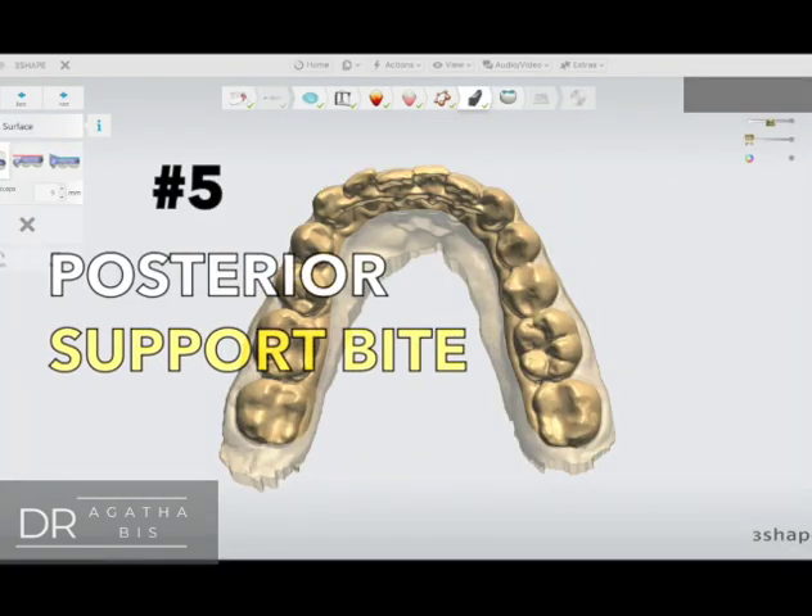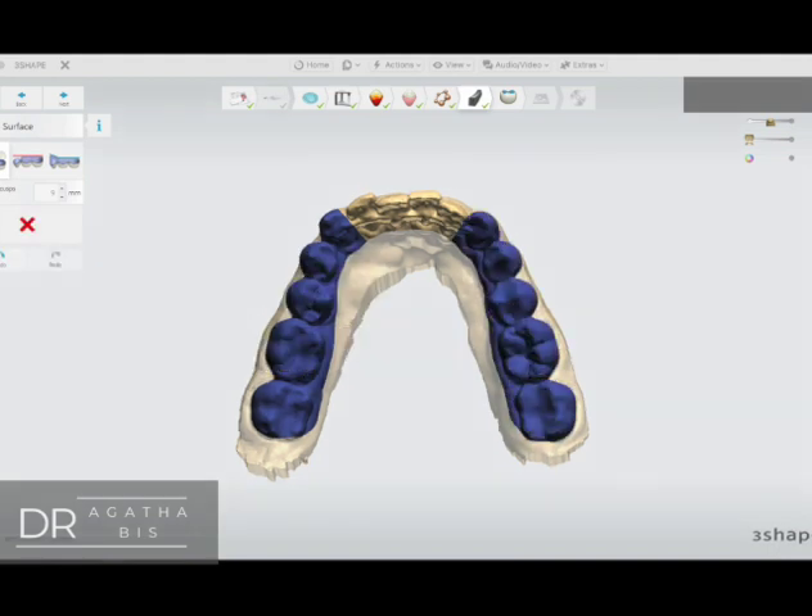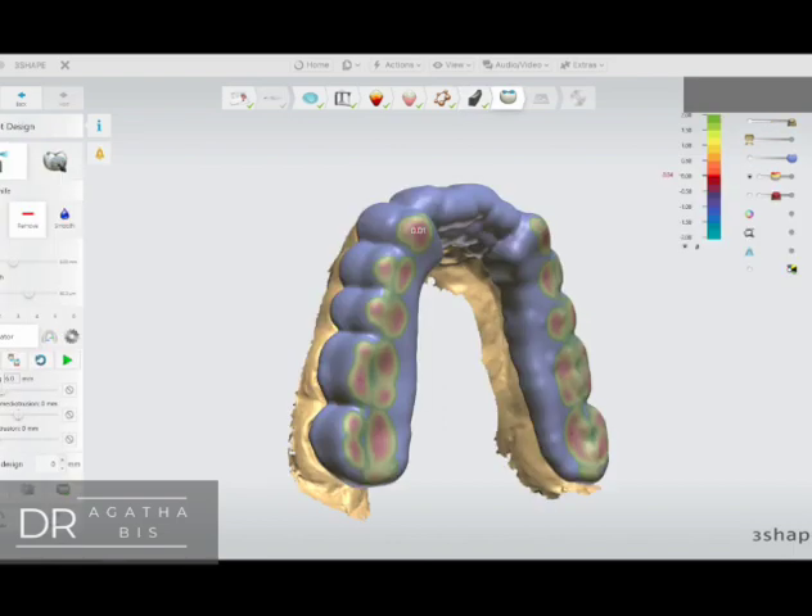Number five: the posterior occlusal surface of the night guard must support the bite. Make sure you raise it up and have solid, even contacts in the back.